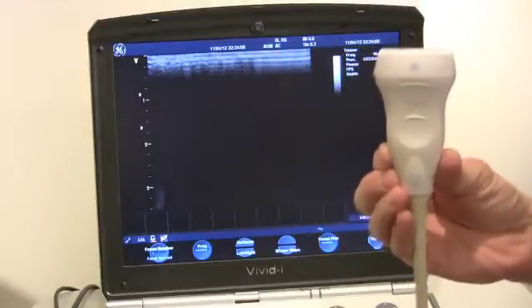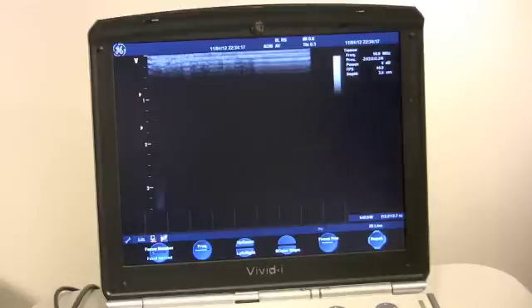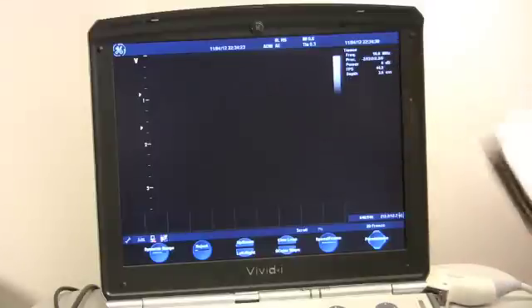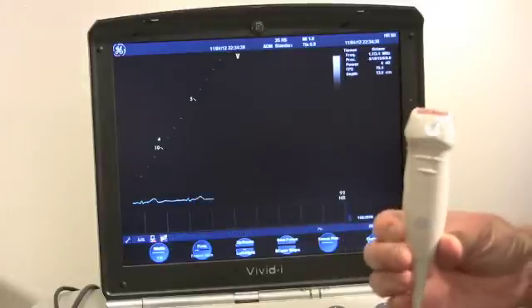You'll probably want to see the cardiac probe with color flow and Dopplers working too, which I didn't demonstrate the first time, so I will show you. I'm taking the 8L probe off and putting the cardiac probe on. We now have the cardiac probe up and going.